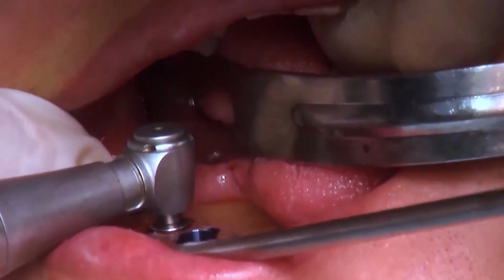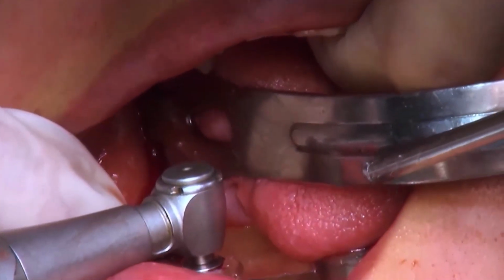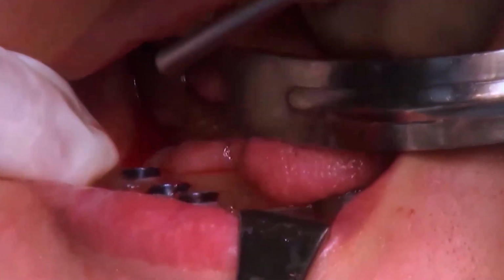The next drill is 2.7 millimeter in diameter and 5 millimeter in length.